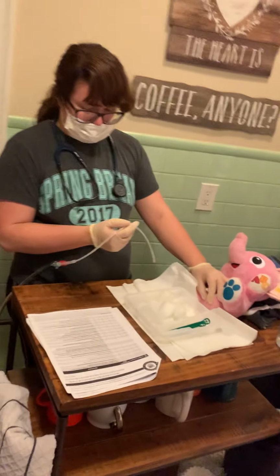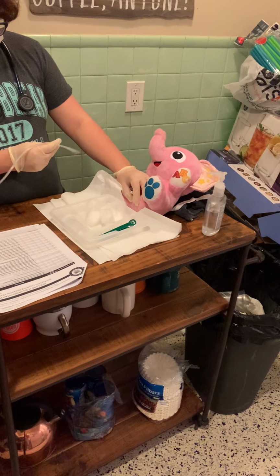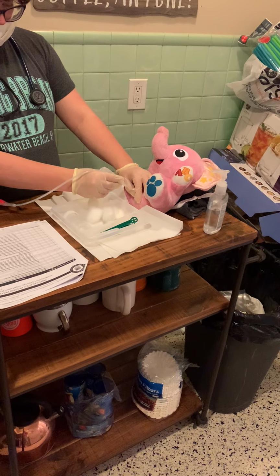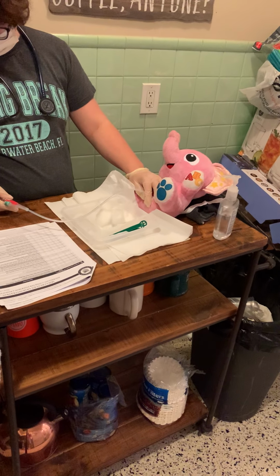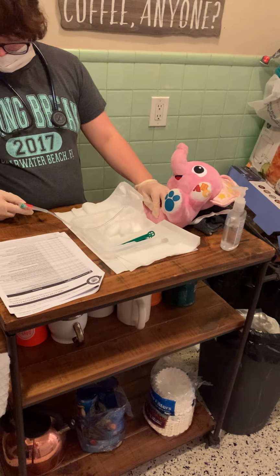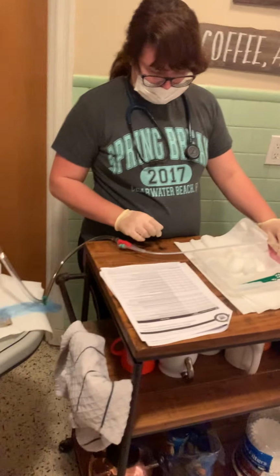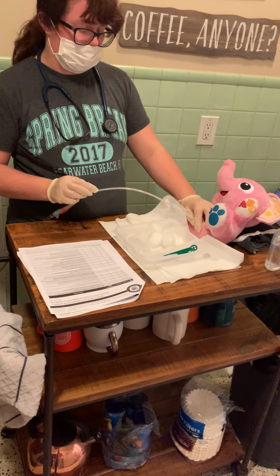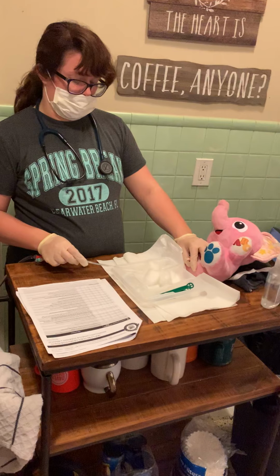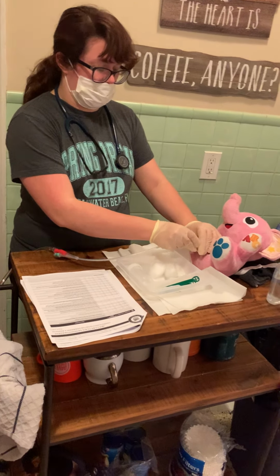Alright, and then I would release the labia after inflating the balloon. You would want to gently pull on it to make sure that it's in place, and it should not cause any pain on your patient when you do that.